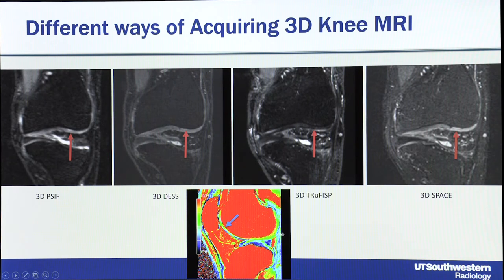Here is a case where you have a small area of osteochondral malacia — this red spot. If you try to look for it on different 3D sequences it's hard to see on all of them except the 3D SPACE, where you can see a blister in the deeper layer of the cartilage — that white bubble — so it's easier to see on this sequence.